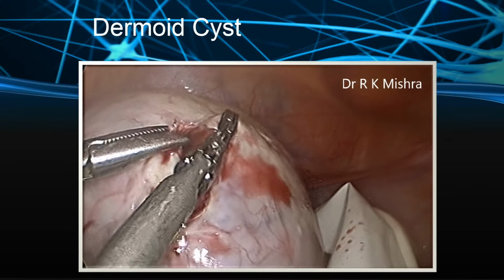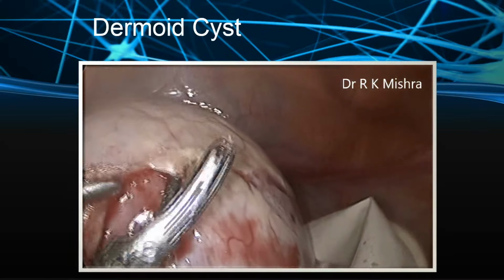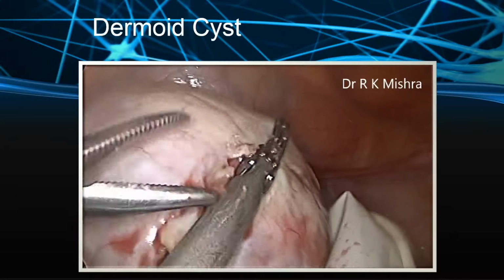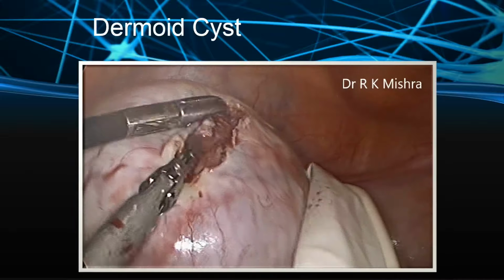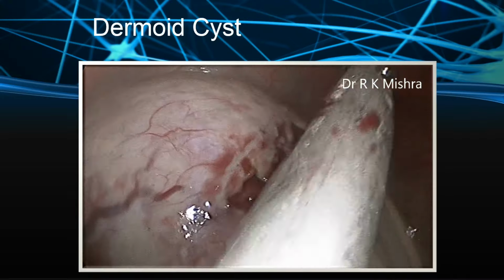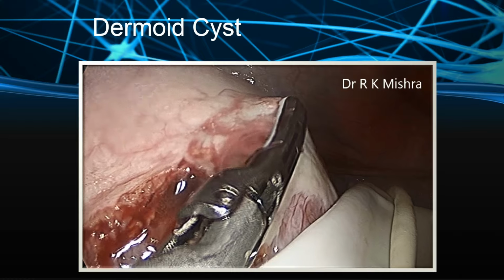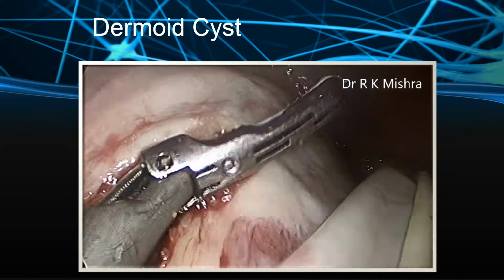And if there is a spill, then you must do copious, multiple lavage. The incidence of chemical peritonitis is very low, rare, 1 in 10,000 to 1 in 1 lakh is reported, and that also can be solved by immediate laparoscopy and again lavage. Some people manage it with NSAIDs and steroids postoperatively if the patient has this problem. But after copious lavage it is rare.